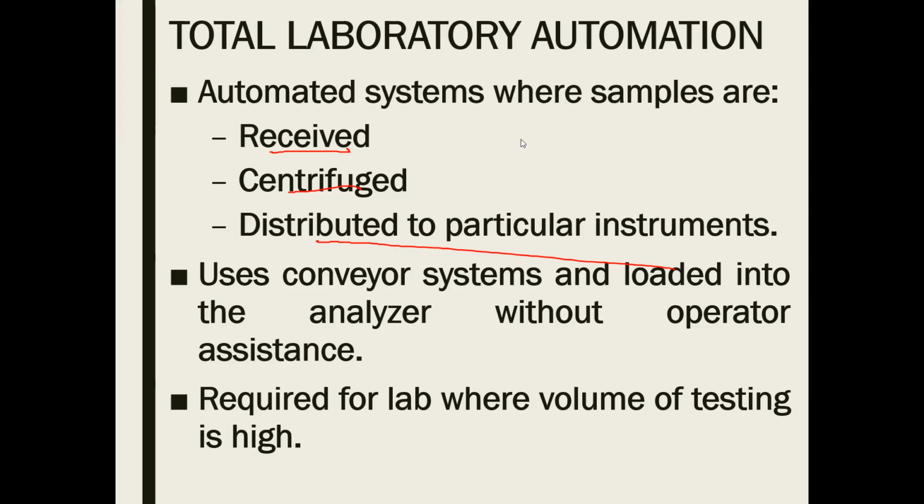Yun. That is your total laboratory automation. It uses a conveyor system. And lastly, it is required in labs where volume of testing is high. Kung sobrang taas niyan, reference laboratory siya, it'd be much better if there is a total laboratory automation. But as per Philippines, I haven't encountered yet a hospital or laboratory which has a total laboratory automation.